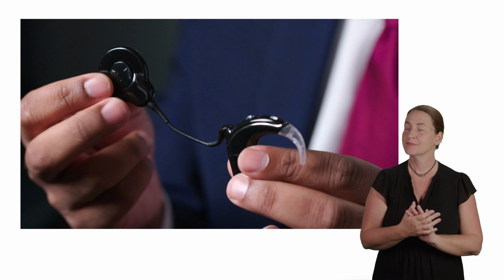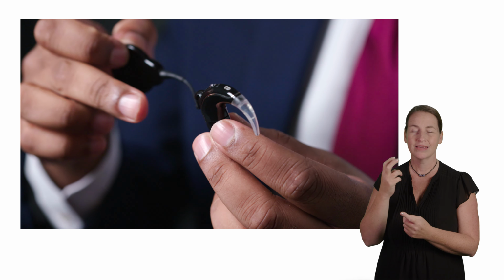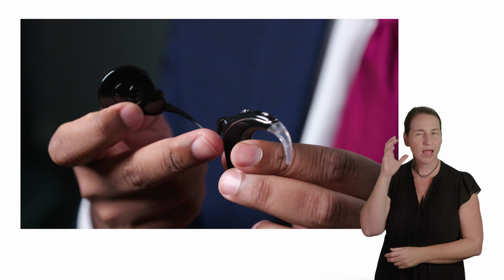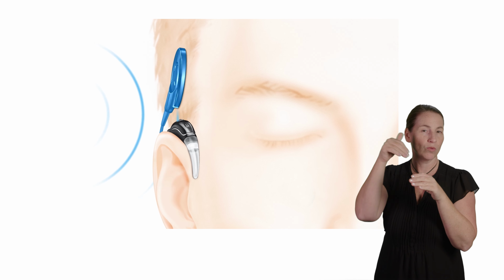Broadly speaking, a cochlear implant consists of two main parts, and each model will look slightly different, but I'm just going to talk you through one. Here we've got the bit that you might recognise, because this is the bit that sits outside of the head and is visible on people that have cochlear implants out and about in public. You've got a microphone and processor, which is also connected to a coil. The microphone in this case sits on the ear, and this hook helps it to sit in place. It receives sound via the microphone, digitises it and sends it towards the coil, which then connects via magnet through the scalp to the internal component.